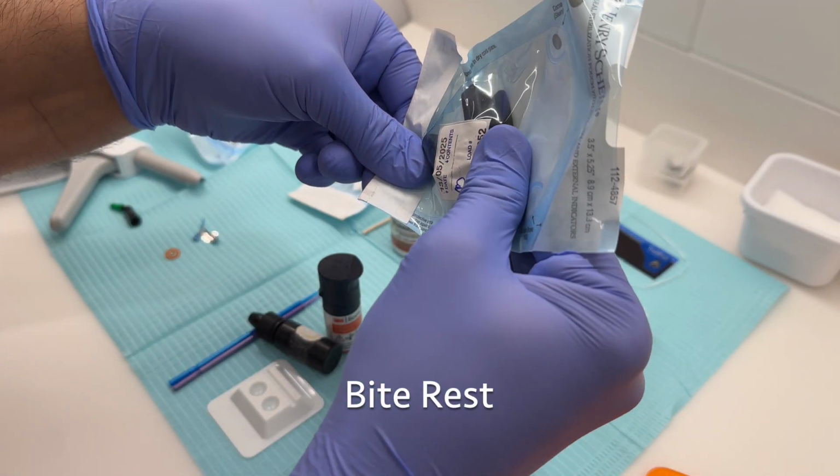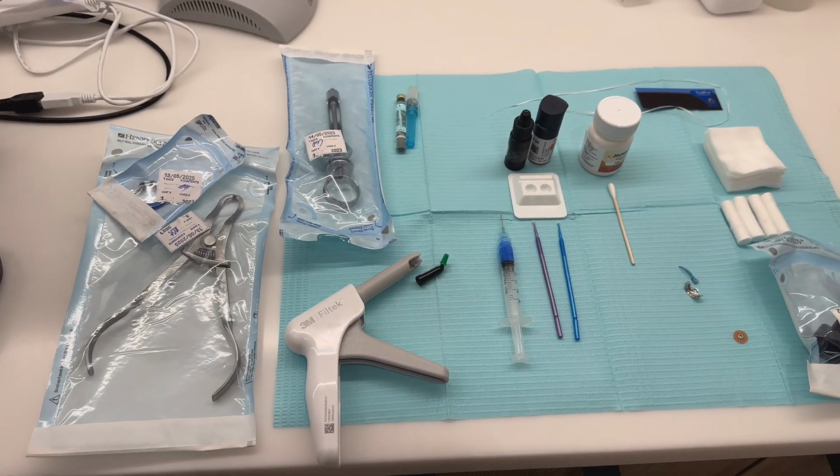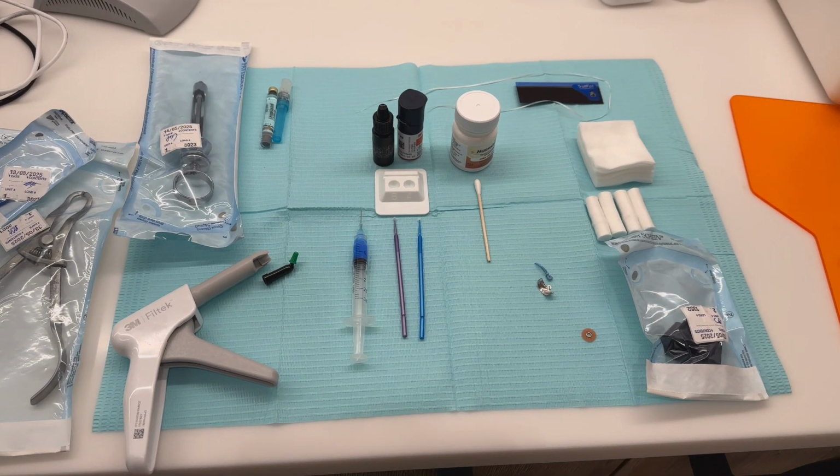A bite rest. Sometimes a bite rest is needed if the patient is not comfortable holding their mouth open the whole time. This can just make their life a little bit easier.